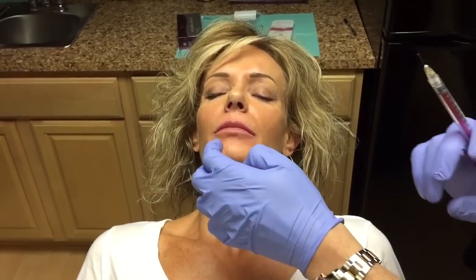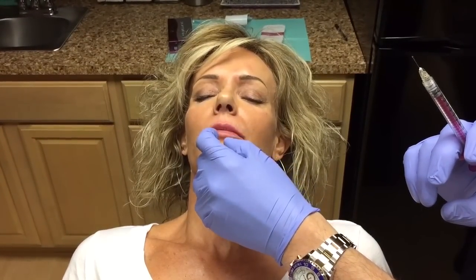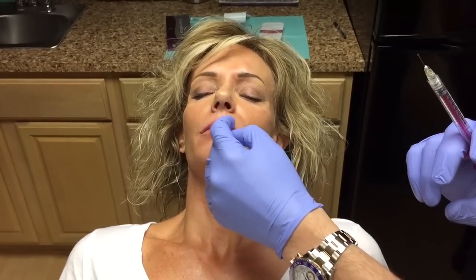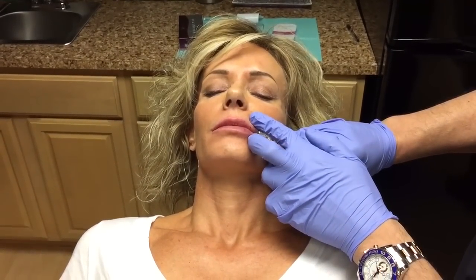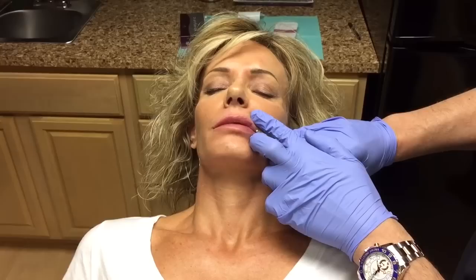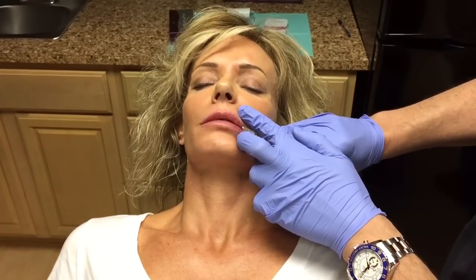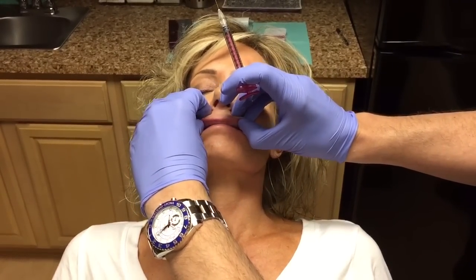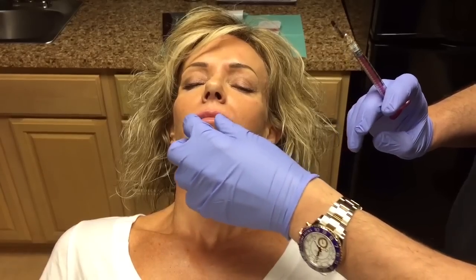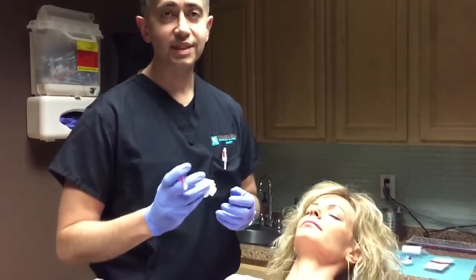Now, if you notice, compared to the starting point, the lips are a little bit more plump. The little lines or wrinkles in the lips are reduced. That side's a little fuller, so I'm just going to augment a little bit here. And then I'm going to show her the mirror. And I'm assuming from no record that she wants to be done now. So we'll finish here. This is a nice subtle augmentation of the lips. And then basically in a month or so, we can add another half a cc and go from there. But that was the technique.